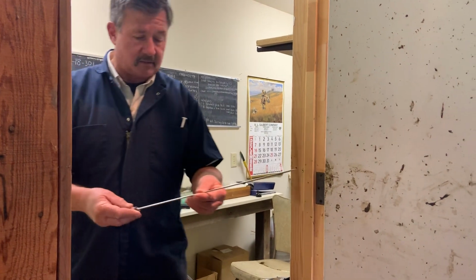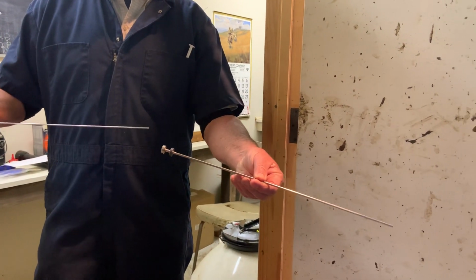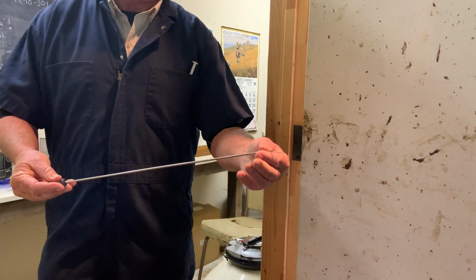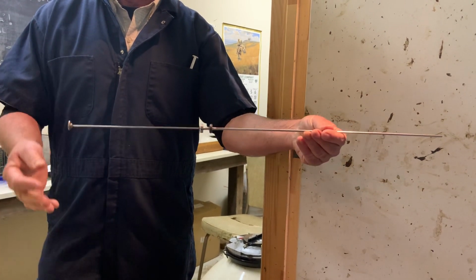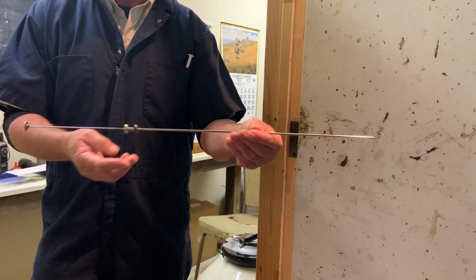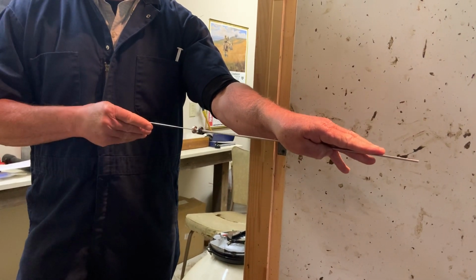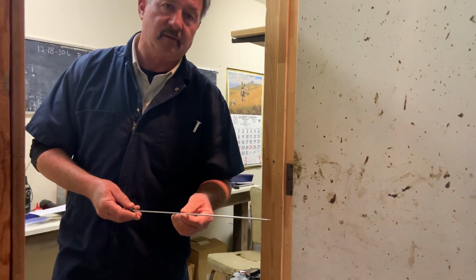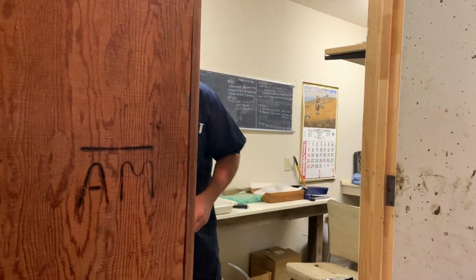The AI gun is essentially a hollow rod with a plunger. We put that rod up into the sheath, and the straw of semen is loaded. The plunger would remain back, and then once we go into the cow and place it through the cervix, when we push that plunger, that deposits the semen into the uterus. So let's bring that heifer up.